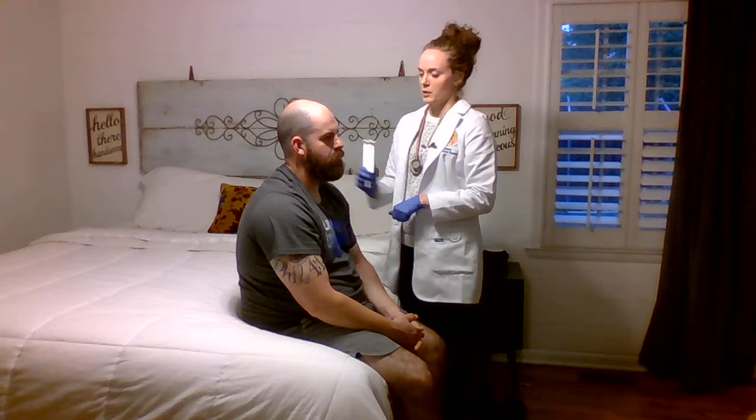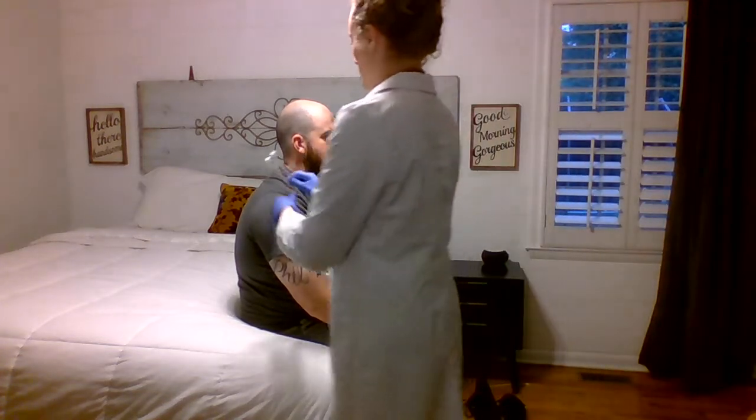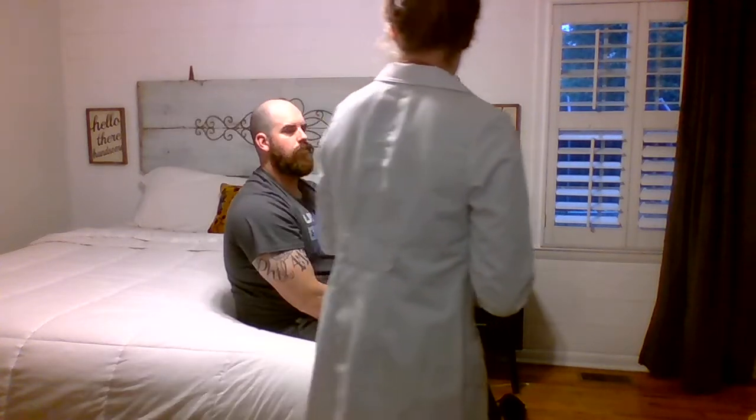Can't hear anymore. Okay, where did you hear it best at? In front of the ear. Okay. Same thing on this side. Nothing. Nothing. Can you hear it on that side? Nope. Let's try it one more time. Nothing. Hear it. Okay, so you heard it best in front of the ear. Yes. Front of the ear.